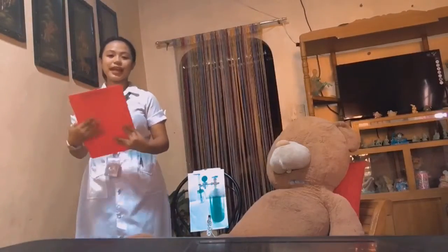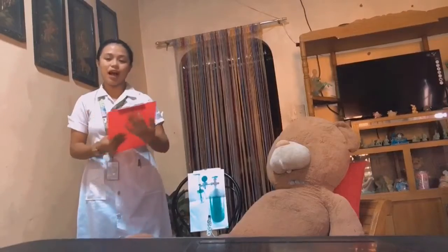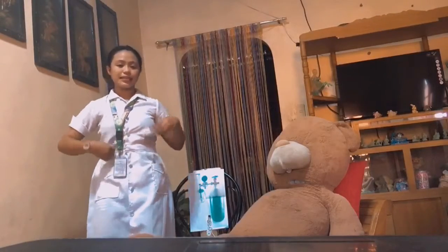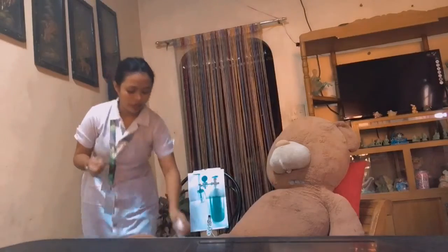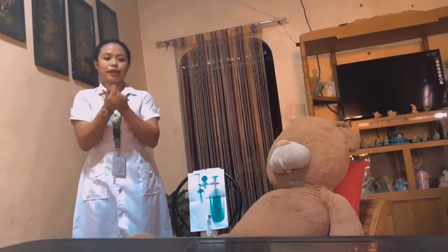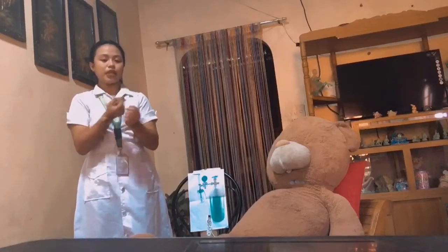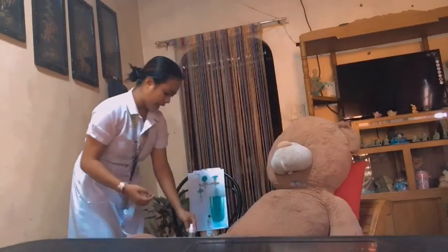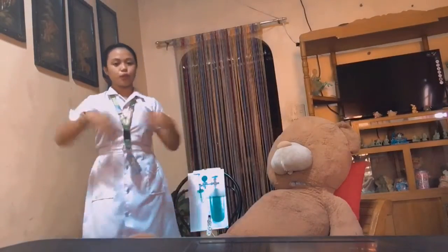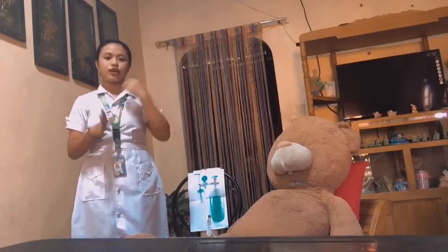Okay, so after explaining, now we will proceed to wash hands and observe other infection control procedures. The rationale of this is to avoid the spreading of microorganisms or cross-contamination among patients or clients, or vice versa. Okay, for the next, we need to provide for client privacy. For example, we need to close the door or close the curtains.